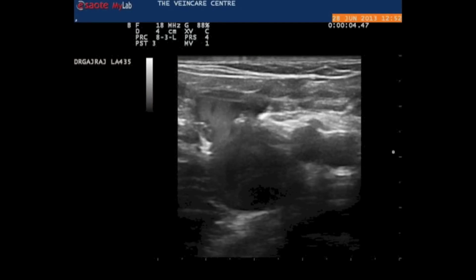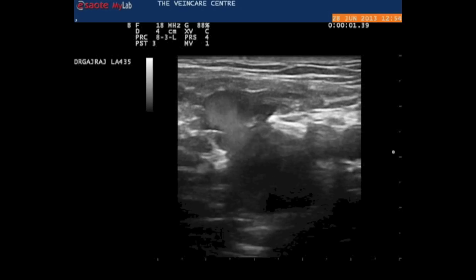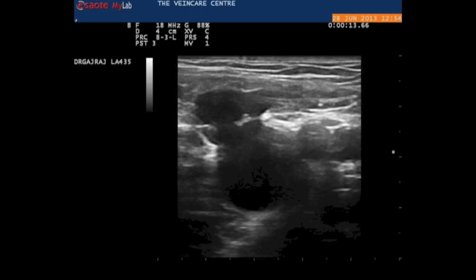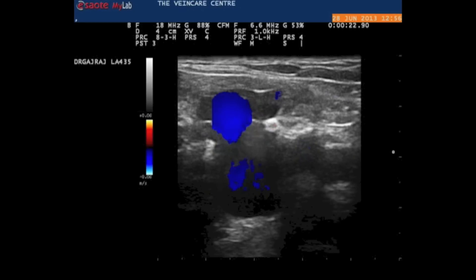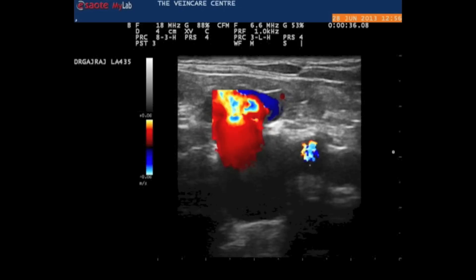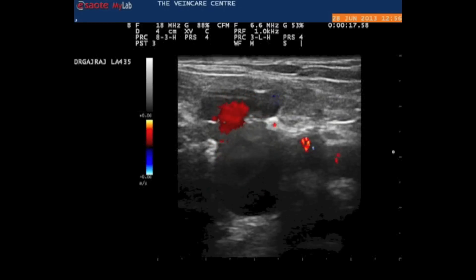So that's a brief explanation of how duplex ultrasound works. This scan shows the junction of the main superficial vein with the deep vein in the groin. You can see the delicate little folds in the lining which in this case are not meeting properly. When I squeeze the leg, blood goes up — the correct direction — but when I let go, because the valves aren't meeting properly, blood comes down in the wrong direction. We call that reflux. Blood flow going up the leg looks blue on the colour duplex. When I let go there shouldn't be any colour because the valves should be shutting, but in this case blood is coming down in the wrong direction and it shows as a red signal.